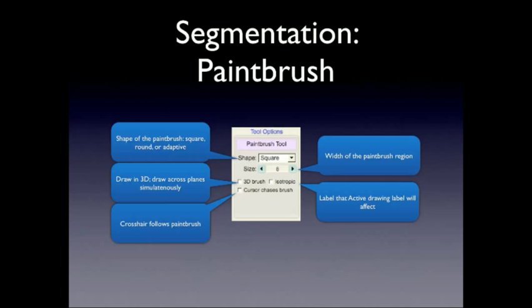Now the other tool is the paintbrush tool. And this is generally, I generally use this for polishing segmentations, for getting like fine edges or smaller regions. So there's a couple options here. You can control the shape of the brush, which will either be square, round, or adaptive. And I'll show you all three of those. Size is just the width of the region. You know, a big brush will cover a wide region. You can use a small, single voxel brush for very precise drawing. A 3D brush will draw across multiple planes at the same time. The crosshair option is just like wherever you draw the crosshair goes, so you can see it in all three planes. And isotropic, that only matters with, basically, it's a 3D drawing method. It really only matters for anisotropic images, so we won't worry about that for now.